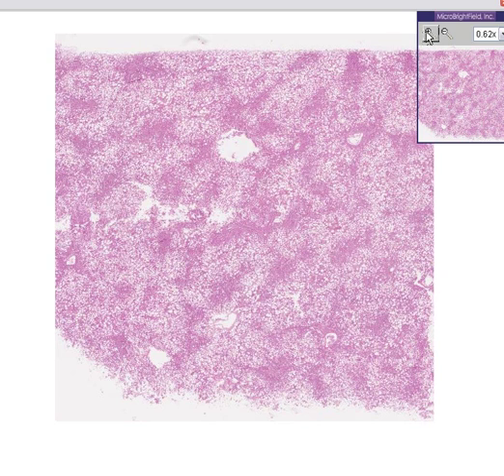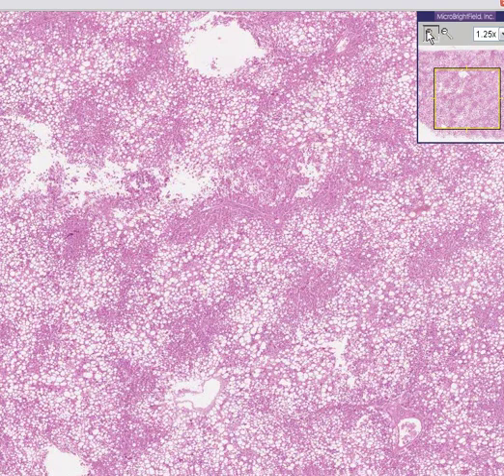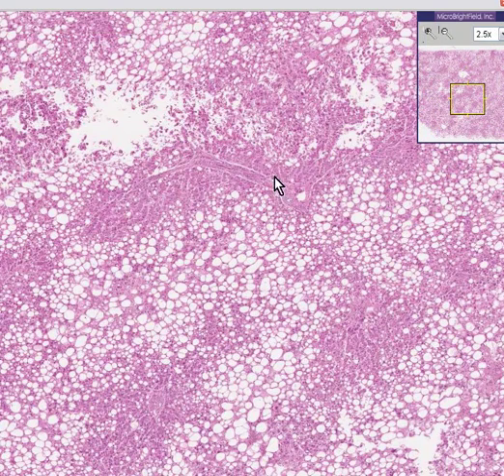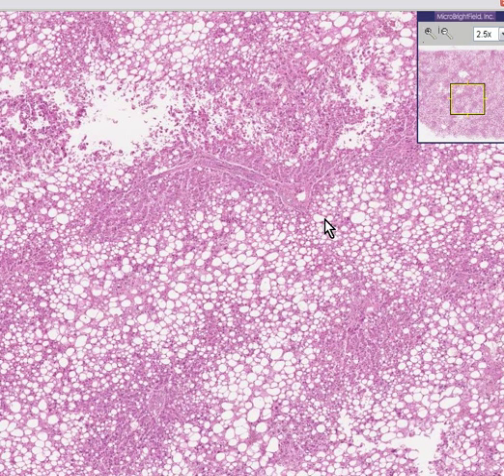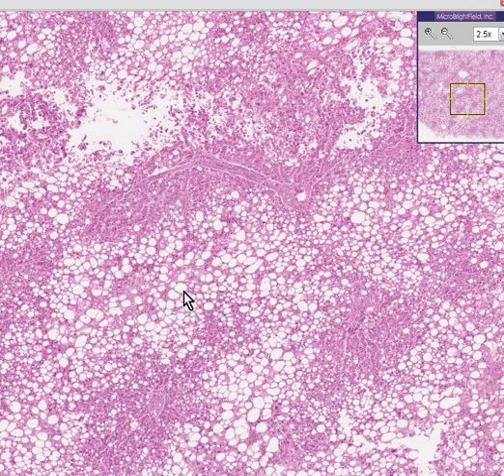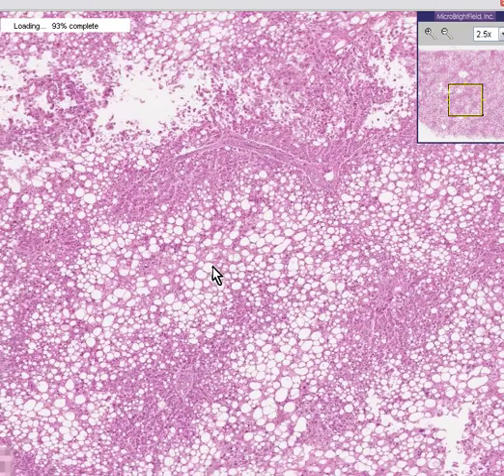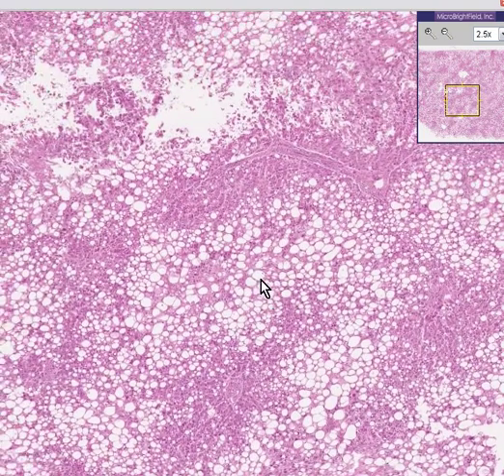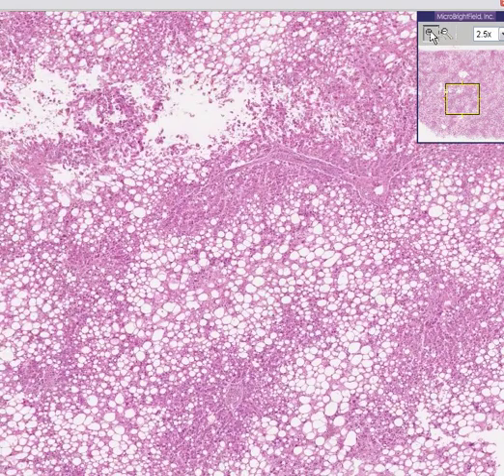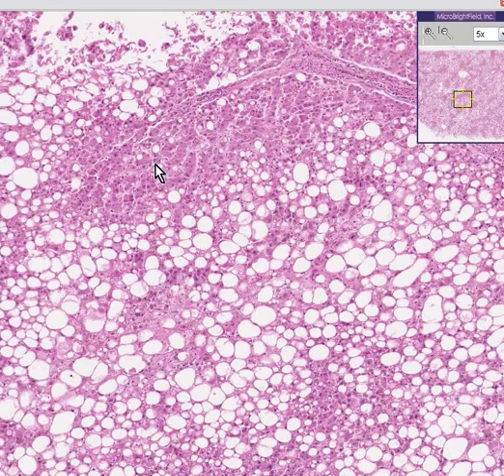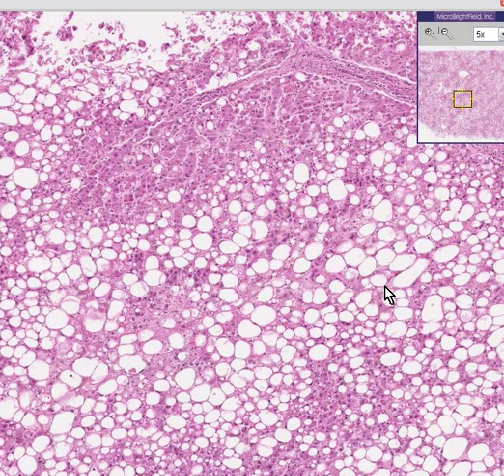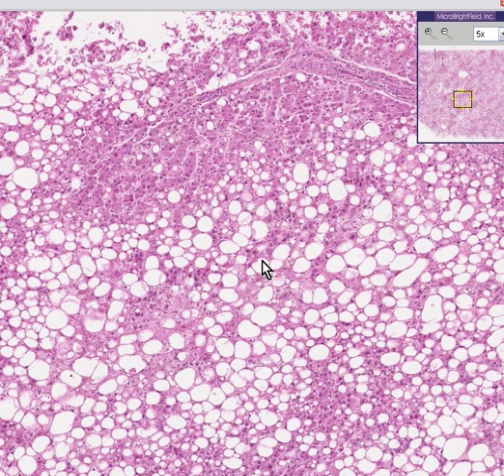And if you zoom in, you'll know that it's lighter because most of the substance of the hepatocytes has been replaced by these large fat vesicles. Notice that in some areas the hepatocytes are relatively preserved, but in other large areas, in most areas of the liver, it's replaced by fat. This is another fatty liver.